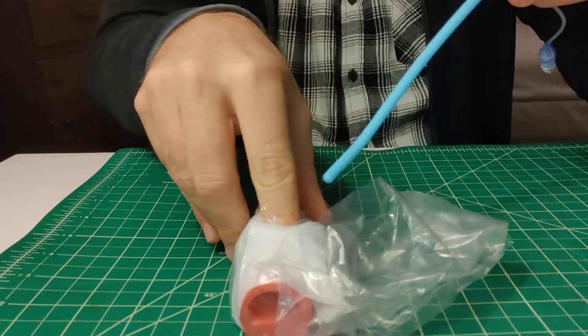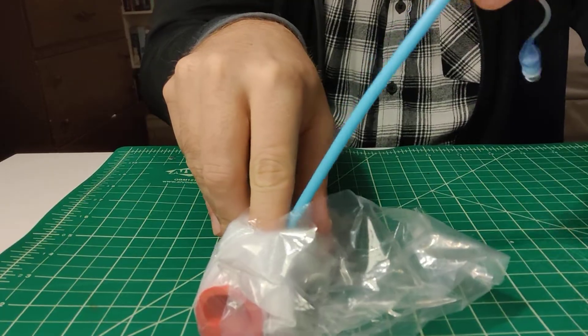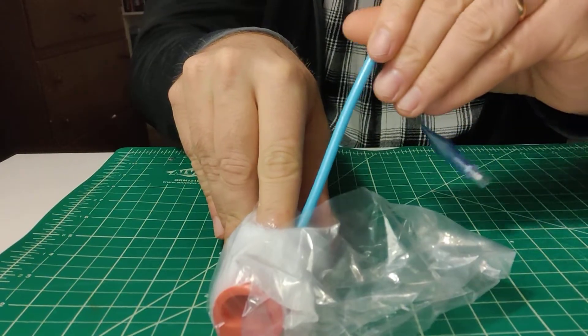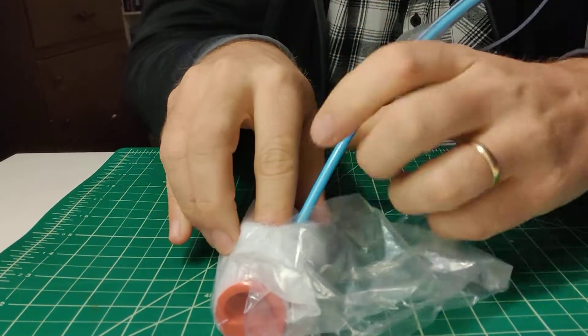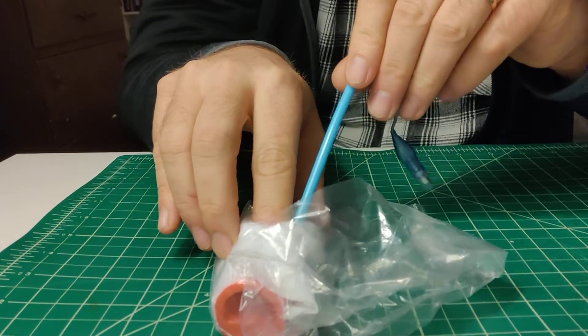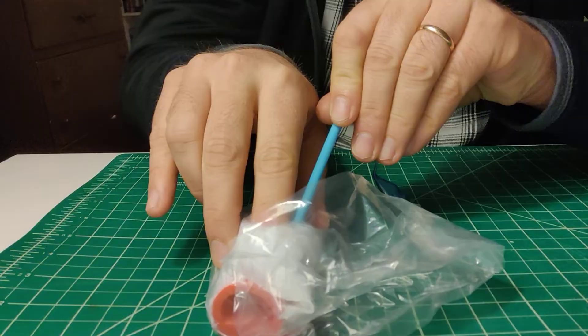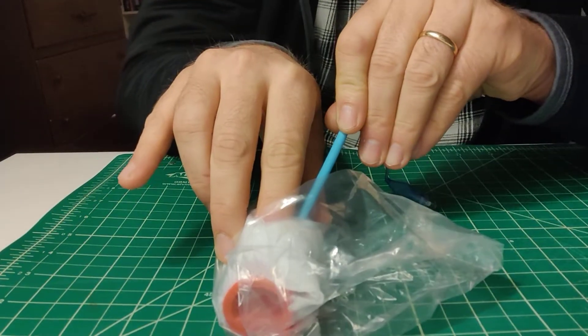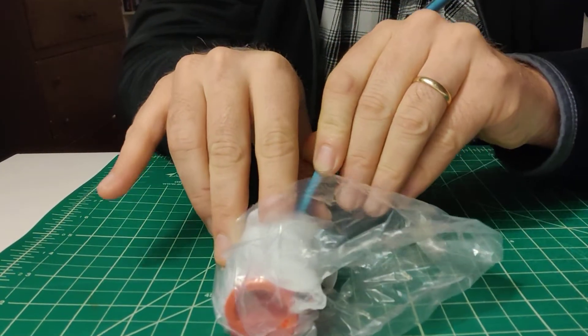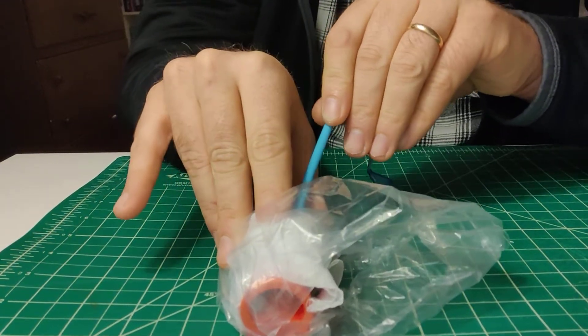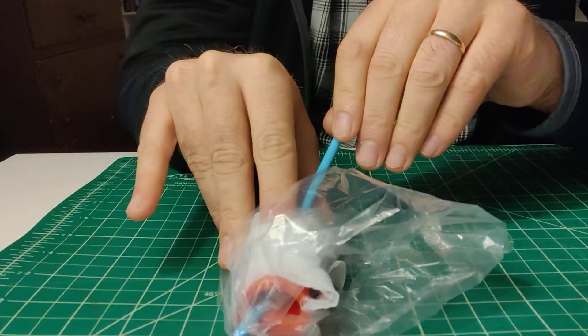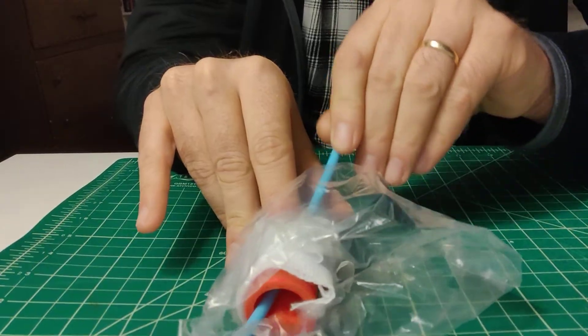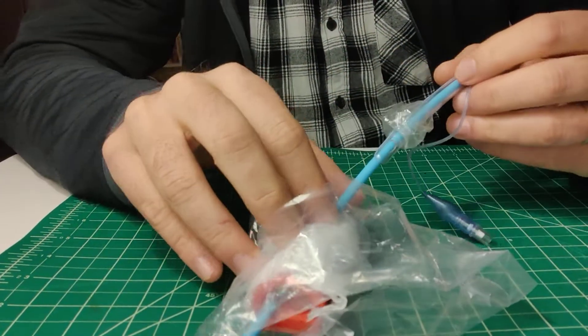And the reason for that is now you take either your intubating stylet, if you don't have a bougie or your bougie. And what you want to do is go behind your finger, touching the pad of your finger, going along the pad of the finger with the bougie and sliding it in into the trachea. And you can retract your finger a little bit as you put the bougie in. And what's nice about this is this is a hundred percent confirmation that you're going in the right space and you're not tunneling sub-Q or something with the bougie. You can feel with the pad of your finger, the bougie going into the trachea. It's nice, it's like doing end tidal capnography on an intubation. It's like that near a hundred percent, highly sensitive test you can do to make sure it's going in the right spot. Once it's in there, you hit the carina or something like that. You're good. You can stop and you advance your tube.